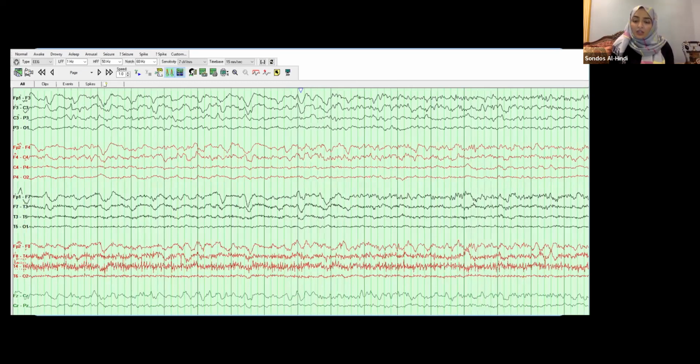However, this was his EEG, right? So is he brain dead? Is this just a confounding EEG, because my clinical assessment showed absent brainstem reflexes? I would say no. My clinical assessment, despite the fact that I did it off propofol, he was not even a full 5 half-lives off propofol, and he was on a low dose of fentanyl. And on top of that, he was getting hemodialysis.